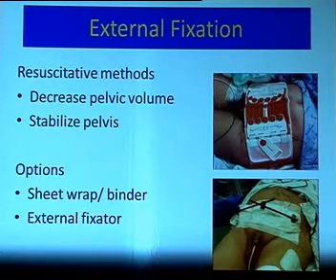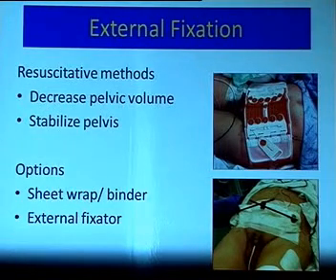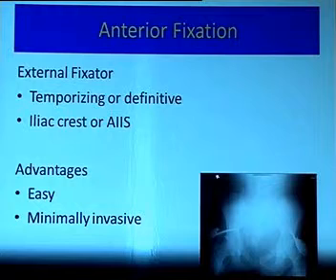So let's talk about external fixation. We talked about its power as a resuscitative device, but it's also used for definitive control of the anterior pelvis. And it's useful as a reduction tool for the posterior pelvis at times. It can be used, as I said, temporarily or definitively, and there's 2 main types of frames people like to use. Originally, there was the iliac crest frame, and we'll get into that, and then more recently, there's the Hannover frame or the anterior-inferior iliac spine frame. The advantage of external fixation is that it's minimally invasive, minimal blood loss, and it's usually fairly easily applied.